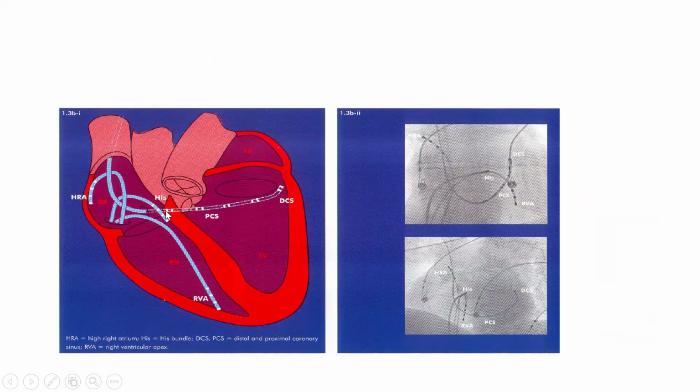Okay, I think around the right atrium. Lower right atrium, right? Yes, sir. If you are sensing atrial activity earlier here than HRA, which is close to the SA node, then it tells you that the activity is starting around here. Do you get that? Yes, sir. So you can now see how we make a diagnosis of AVRT.